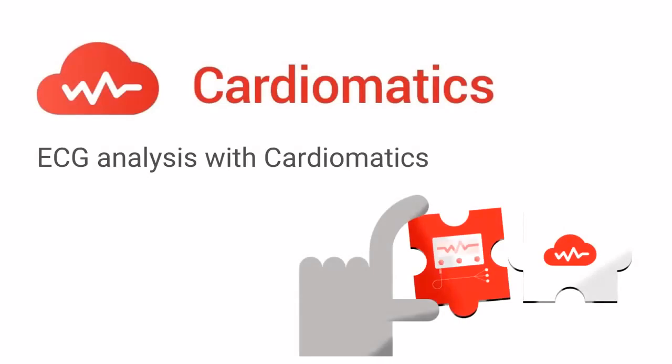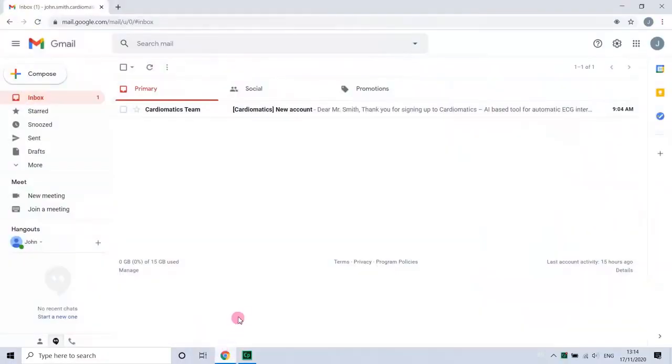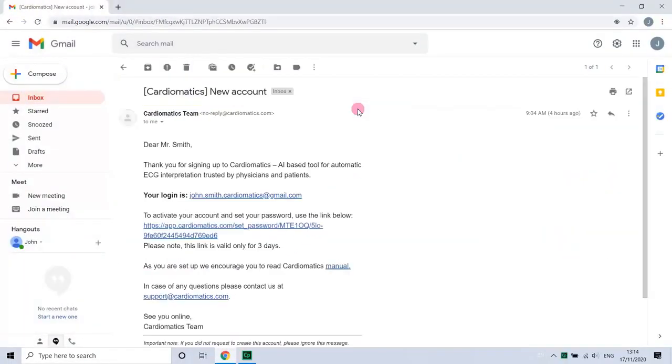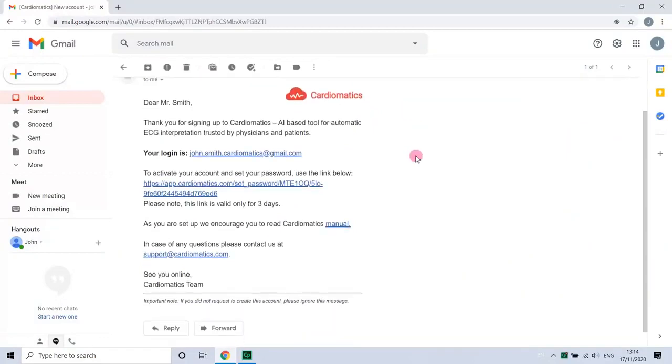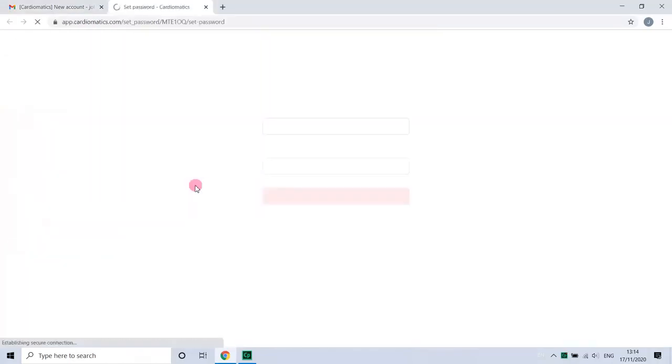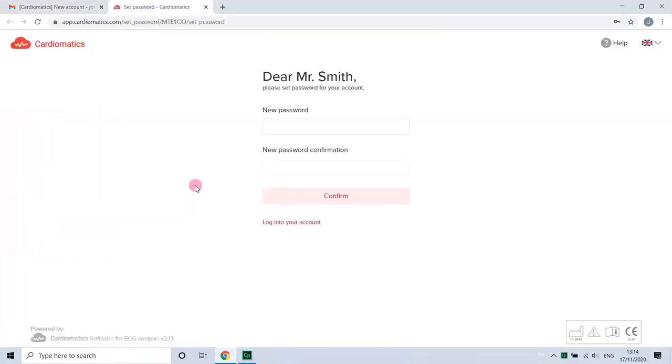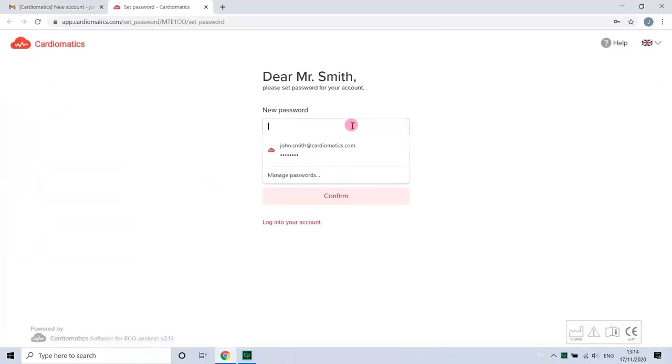Welcome to the world of easy and fast Holter ECG analysis with Cardiomatix. To activate your account, click on the link in the email and you will be transferred to the login page. Now set your password and confirm.